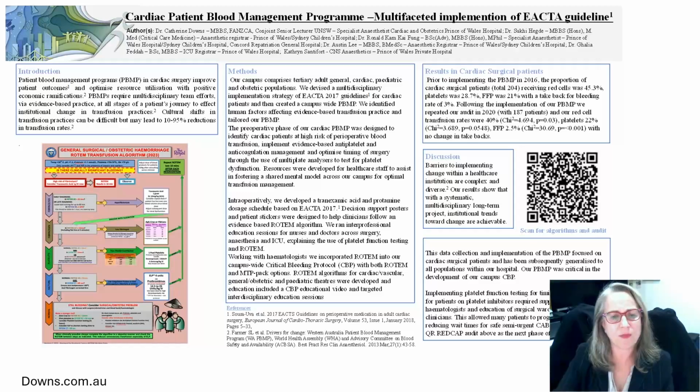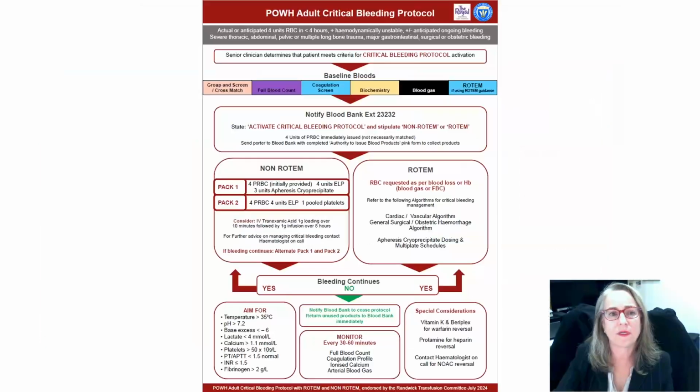This is a poster that we presented at the college meeting this year, and it essentially goes over our algorithms, some of our statistics and how it's gone, and the QR code where we can look at the algorithms, and it's also got an audit in there that we're doing. So just to point out that when you implement it locally, you need to be auditing it and looking at what you're doing. And this is also available on my website there, downs.com.au, if you want to read this poster. I'm not reading it now.